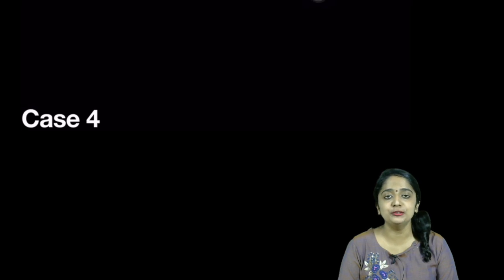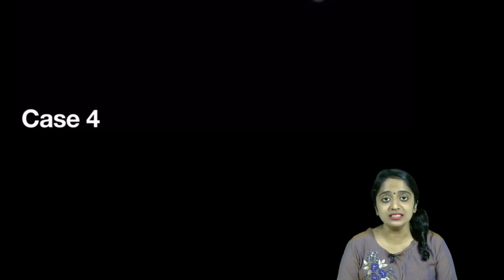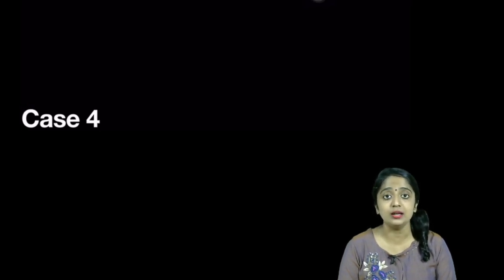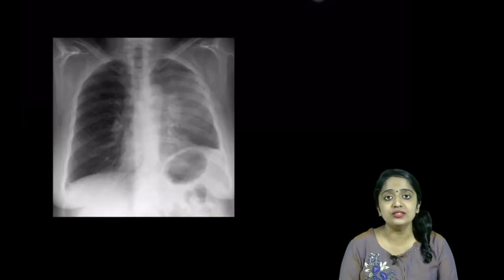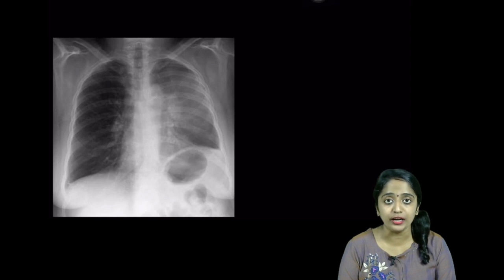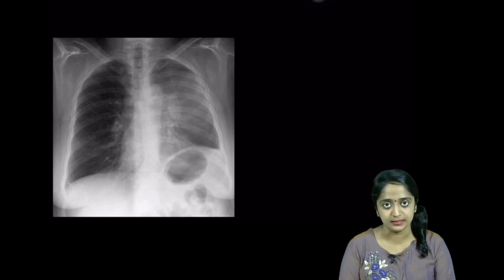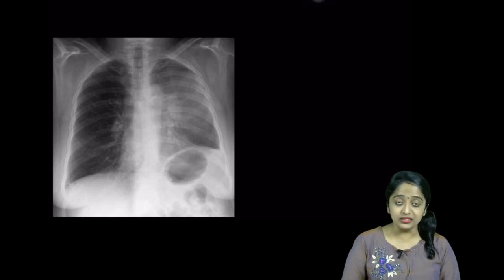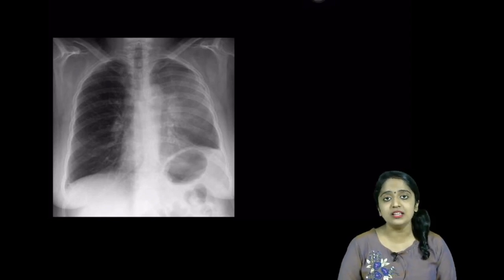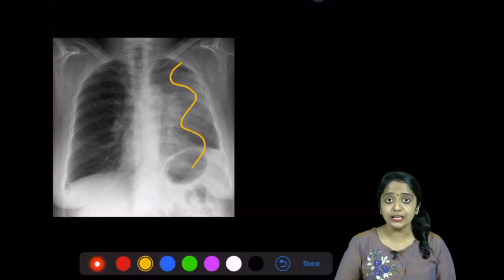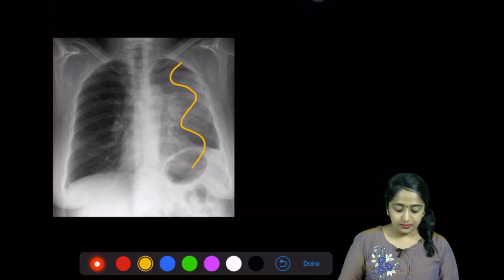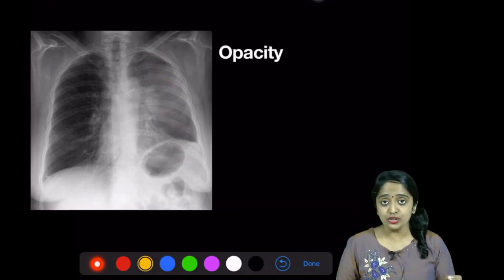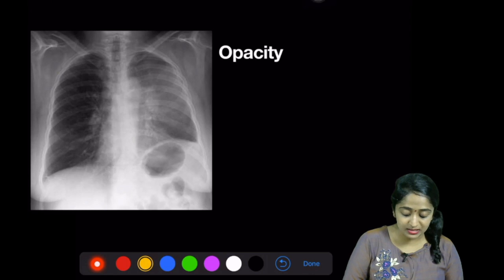Welcome back to module 5 of the collapse in chest imaging series. In this we shall discuss a particular case to identify the pattern of collapse. This is case number four — given to you is a radiograph. You can pause for a moment and try to find out all the positive findings. First and foremost, is the radiograph normal? The answer is no — this is abnormal. The abnormality is in the form of an opacity. The next question is: where is the opacity? You can see the opacity in the left hemithorax.